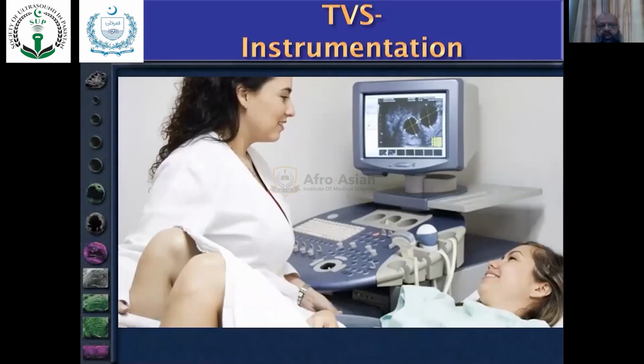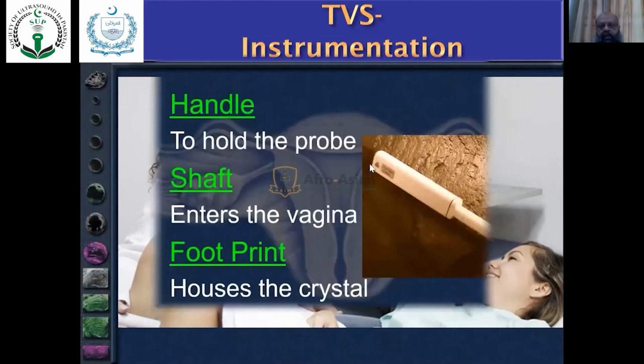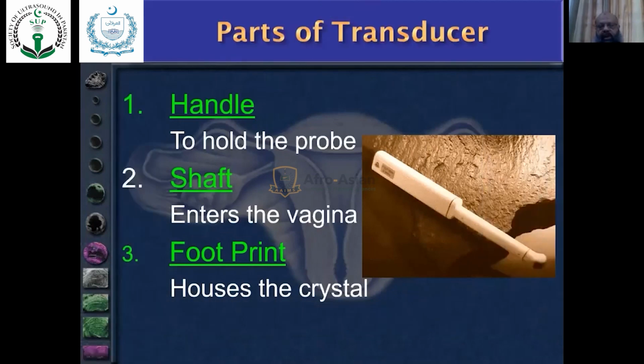The first thing we need is a machine, an ultrasound machine with better resolution, better facilities, preferably having color Doppler, power Doppler, and it will add a lot if we have power Doppler with 3D or 4D, and power Doppler with directional, and tissue harmonics.